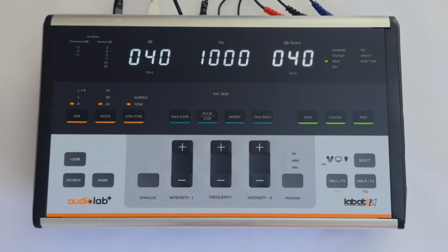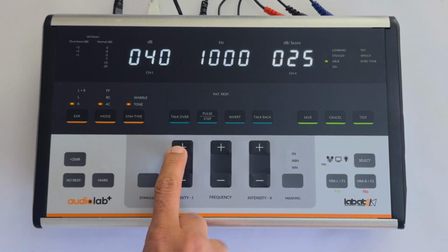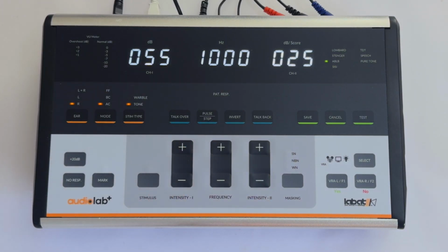Select the frequency at 1000 Hz. Set the intensity of the good ear and the poor ear as per patient's hearing threshold. Press the stimulus key to present the tone. The tone will be presented alternatively between both ears. Change the intensity of the poor ear till the patient confirms equal loudness in both ears.